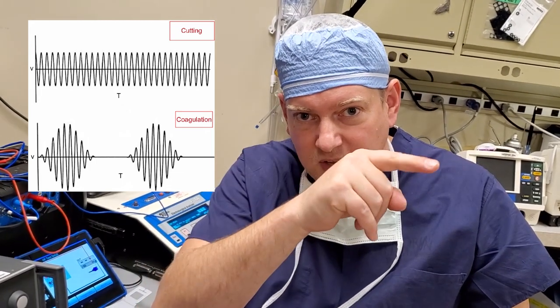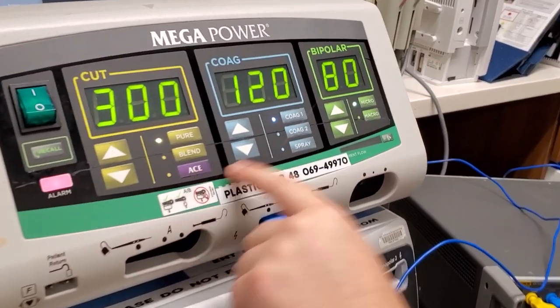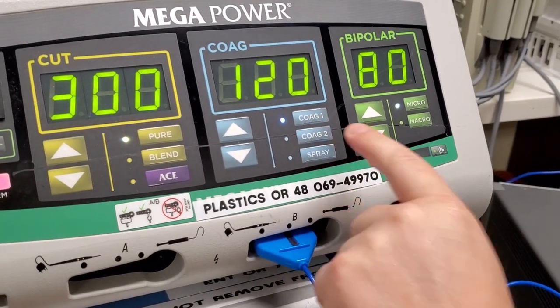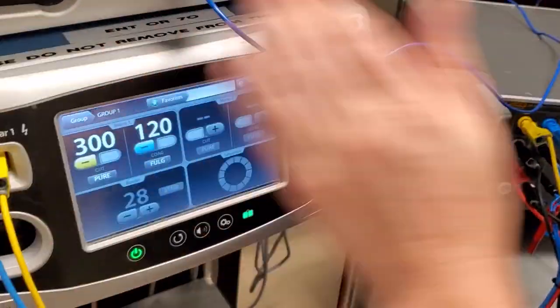As ESU energy heats up tissue you can cut it — tissue falls apart at a certain amount of heat. For cut it's a straight waveform, and for coag it's pulse, stop, pulse, stop, pulse. Coag is for coagulating blood and cutting some tissue, whereas cut is mainly just to get in there and cut that tissue. There are a variety of different other waveforms that units can do — spray, coag one, coag two, micro — but usually when we test, we test on pure cut and coag one. Now let's run through how I would test this device on the QA ES3.